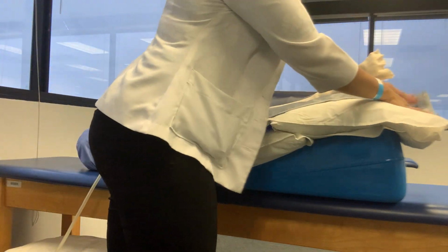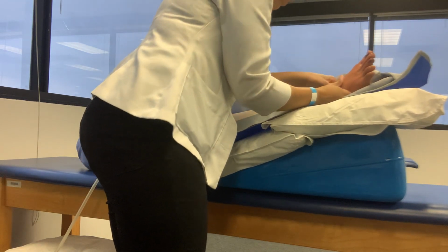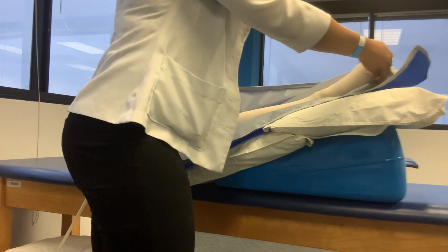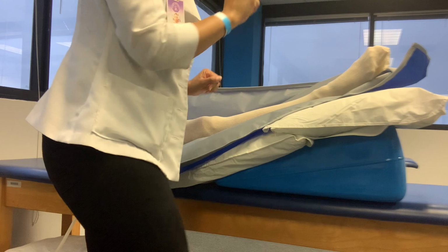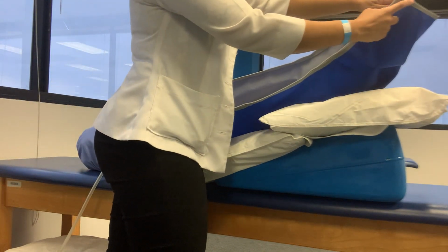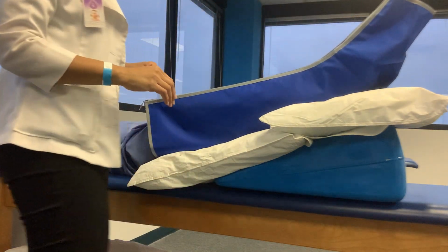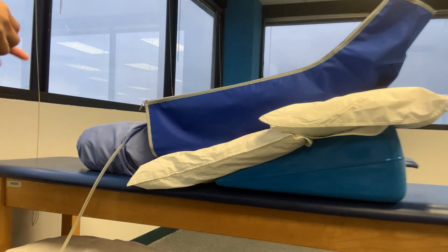Then I come to the foot, and I do the same thing. I roll it down a little bit to about the ankle, and I look, and then I slide it up. And then this is where, when it's a little bit long, it helps to check proximal, check distal, then give it a tug, and it smooths everything out. Then I go ahead and close my sleeve again. And now I'm actually ready to start my procedure. So now I'm ready to start.